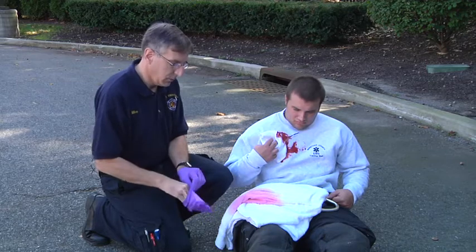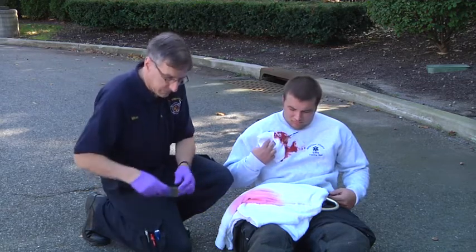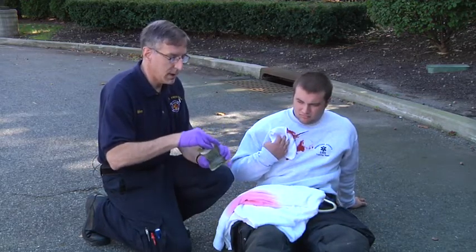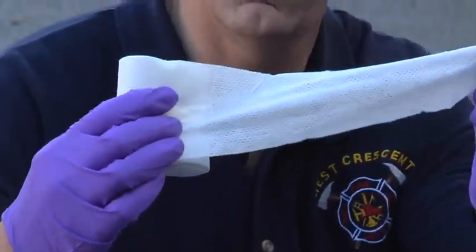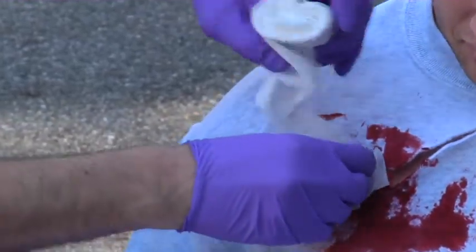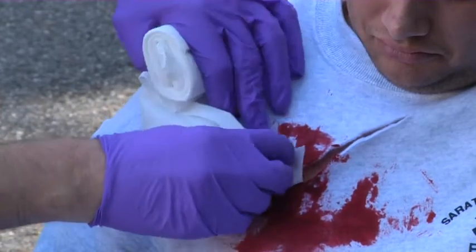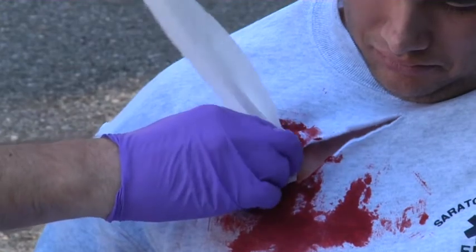So I'm putting some gloves on to control bleeding from the patient using Combat Gauze. I'll open up the sponge, and we actually have what's a roller of gauze. The entire roll of gauze is impregnated with hemostatic agent. So we're going to take the roll of gauze and stuff it into the wound very quickly. What this is doing is causing the gauze to have contact with the area of the wound that's bleeding.